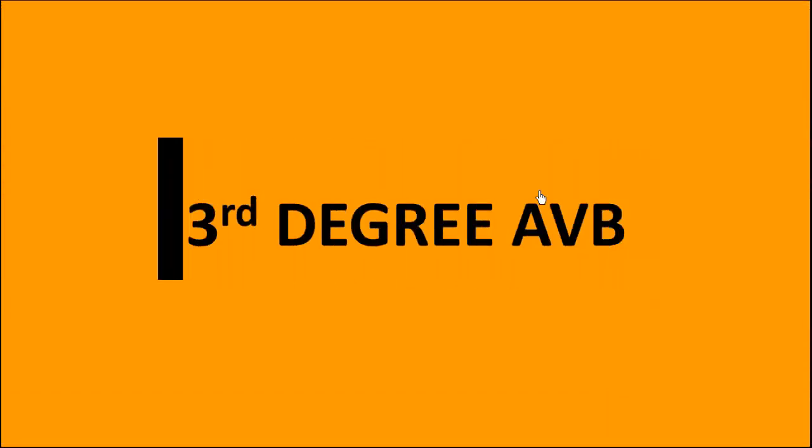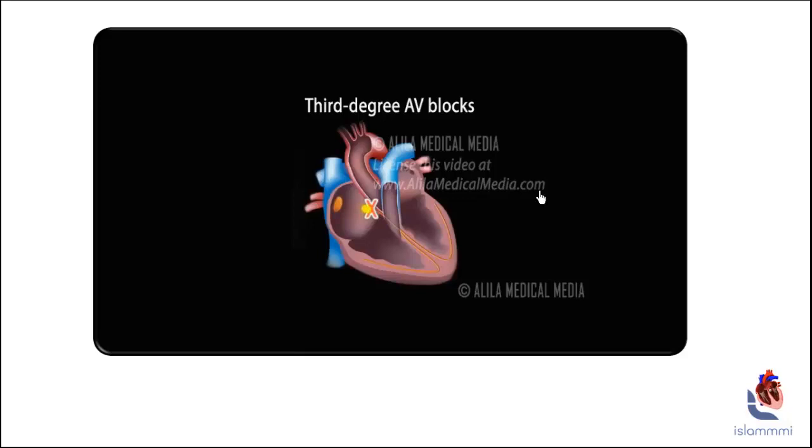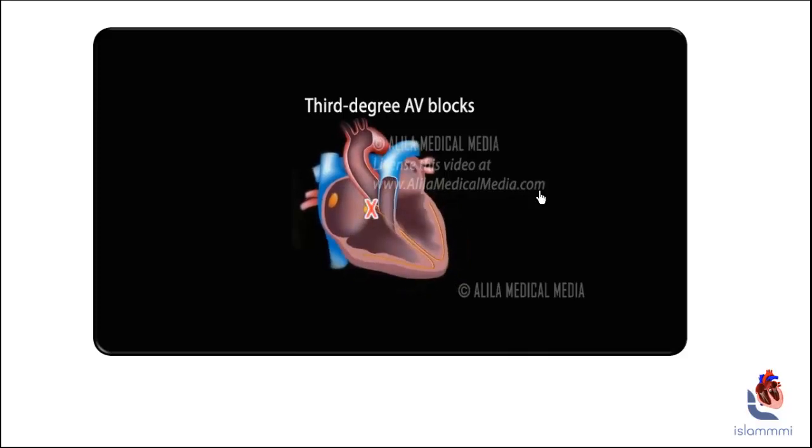So what about the last one, which is the third degree? This is the most serious one. The patient might have to go to the cath lab to insert a pacemaker. In this case, the atrium is working through the SA node, but none of the impulses are crossing. So the atrium is working all alone. The ventricle has to find another pacemaker again.